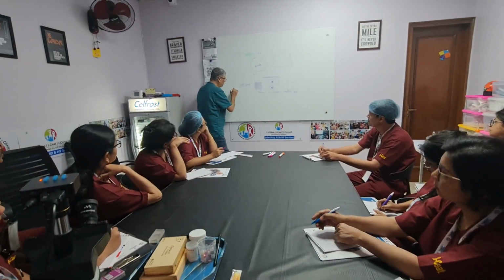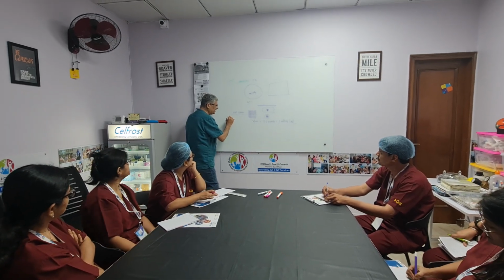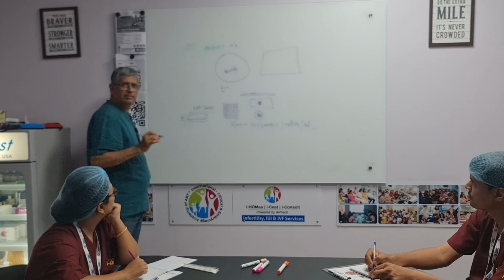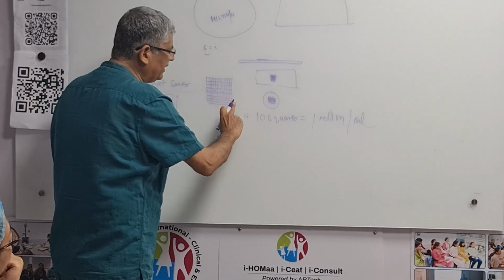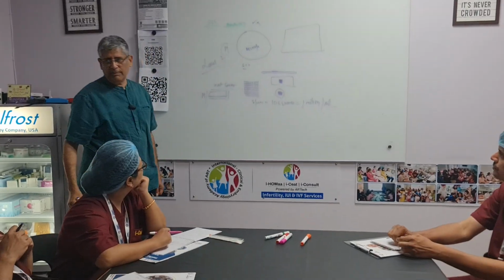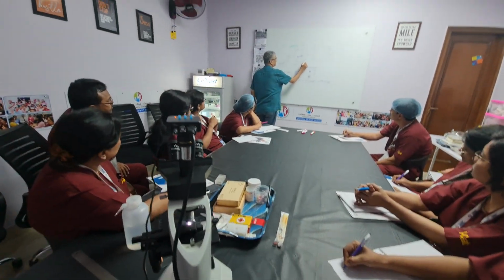When you want to do morphology, or anything which needs more clarity, then we have to go on the slide, which is 3 inches by 1 inch. This method is a very important thing, and for a level 2 ART clinic it is mandatory. For level 1, it is not mandatory. It costs somewhere around 30,000 plus GST. That's the pricing of what we have.